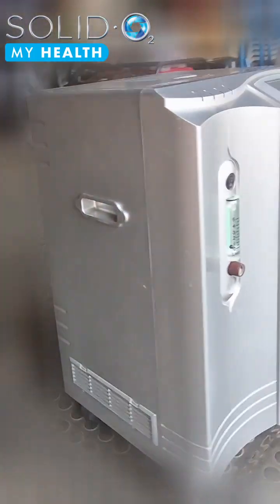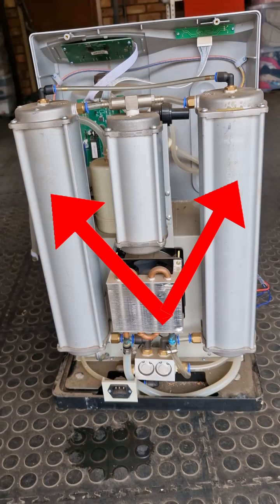Today, I'm going to be speaking to you about servicing your own concentrator. It's important to note that servicing your own concentrator does not mean it's going to fix a low purity alarm. That's right. A low purity alarm has got to do with your sieves. Your sieves are a wear and tear item that needs to be replaced.